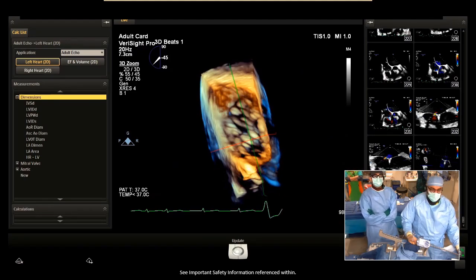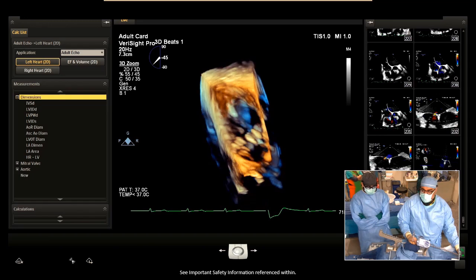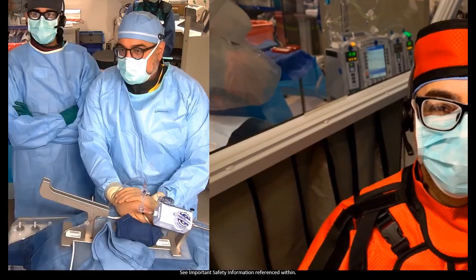All right, great. So there you can see one clip in the AS segment. And I like the way this looks. So final comments, if you can just show Dr.